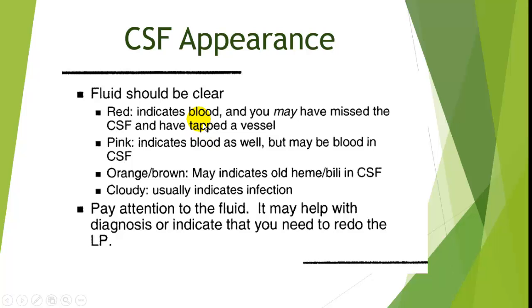You should be able to tell fairly readily whether you've had a traumatic spinal tap, in that you'll see either red or blood-tinged fluid. If it's frankly red fluid, then you probably did a venous cannulation and probably don't want to use that as spinal fluid. If it's pink, that's when you want to see if it clears and obtain fluid in both the first and fourth tubes to compare and see whether there's clearing of the blood as an indicator that you in fact had a mildly traumatic tap.